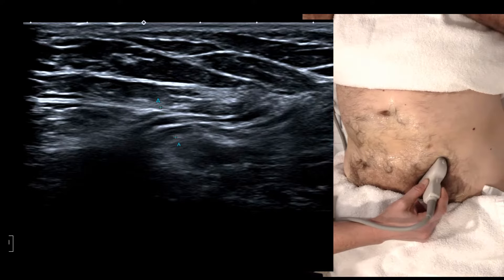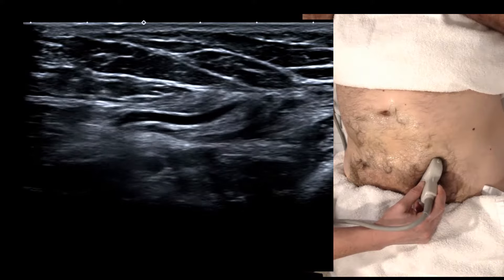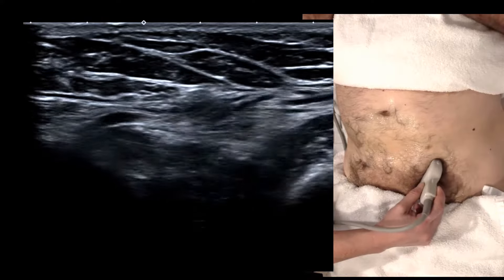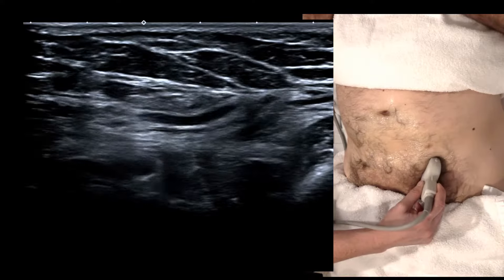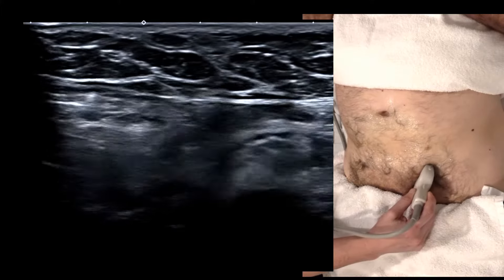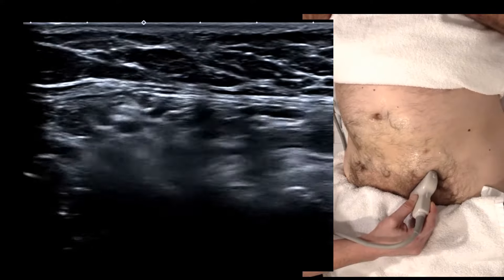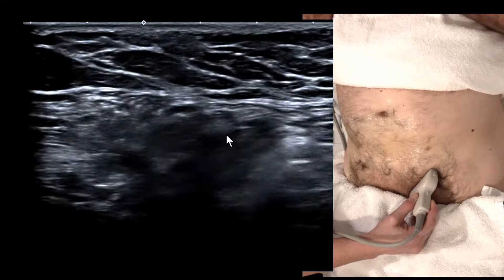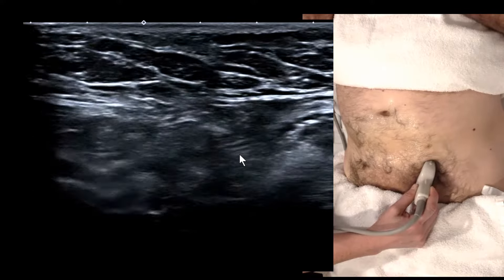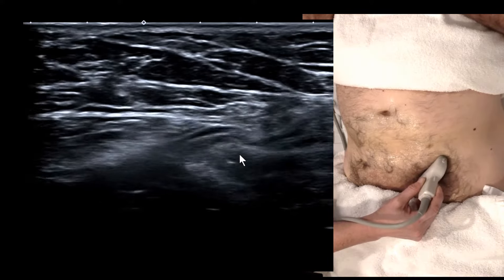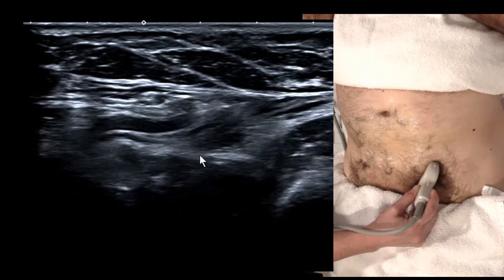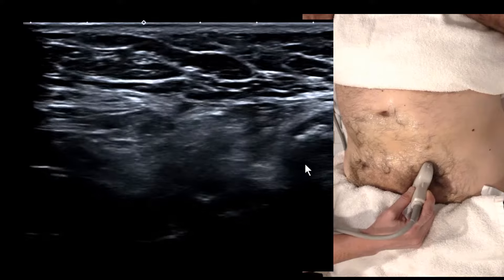The thing to note is that in all normal men the spermatic cord should slide, and the spermatic cord measures about 10 mm. The biggest pitfall is that sonographers can get excited by seeing the spermatic cord move across the screen. If it's containing black veins and an artery, it's not a hernia — hernias must look like intra-abdominal fat, containing something without veins.